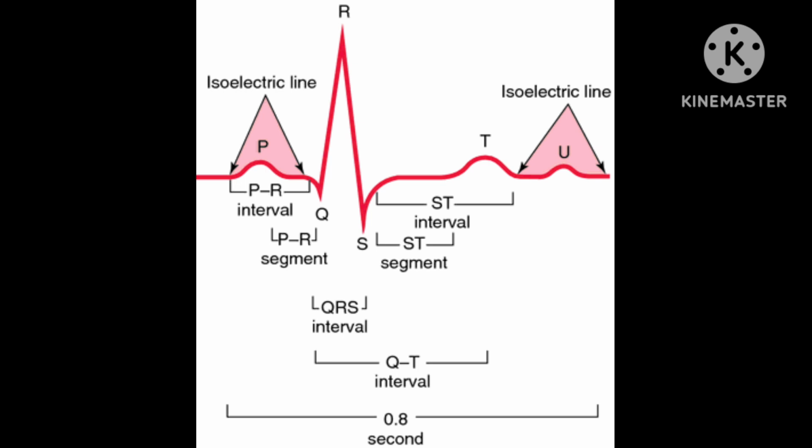Now I want to tell more about ECG. I am giving more focus to the working principle, not other details. It works on the principle that a contracting muscle generates a small electric current that can be detected and measured through electrodes suitably placed on the body.